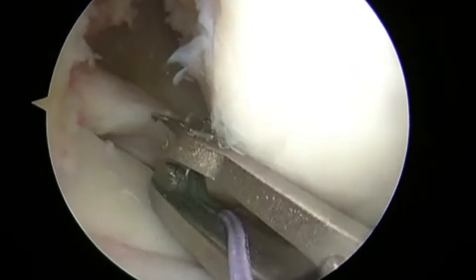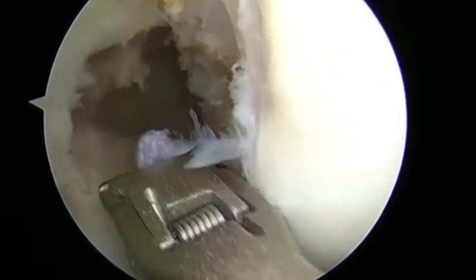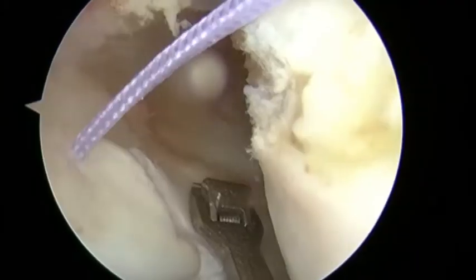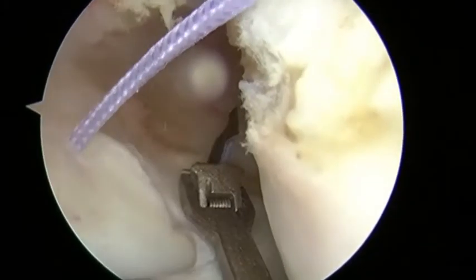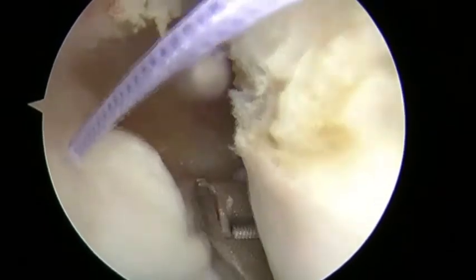The antegrade suture passer is loaded with an Orthocord #2 suture. The suture is passed on either side of the radial tear. The knot is tied arthroscopically to bring the radial tear together.